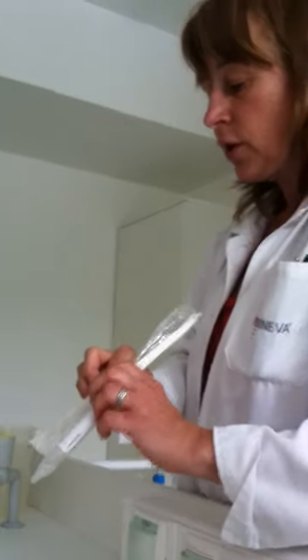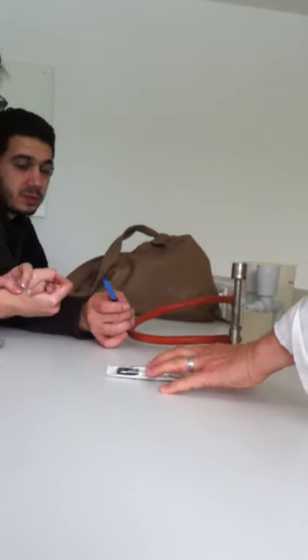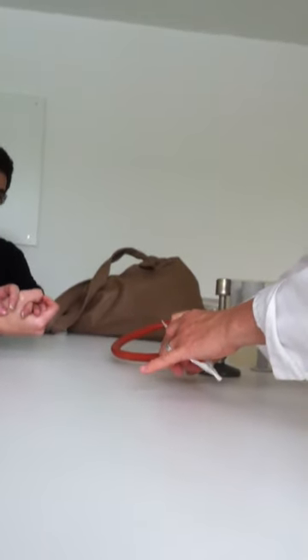You should. It depends on the time. Within 2 hours you shouldn't, but after it you should. Okay. So there was a blue one, a black one. The black one for fastidious bacteria, or if you prefer the smaller swab.